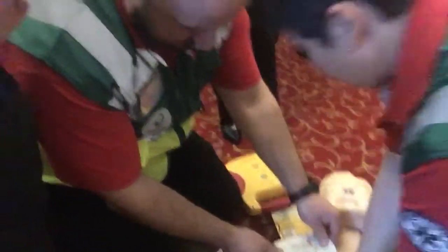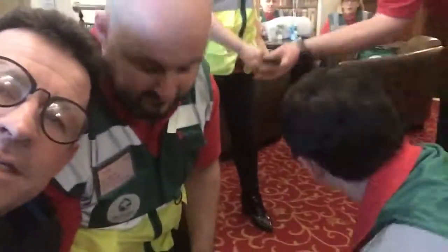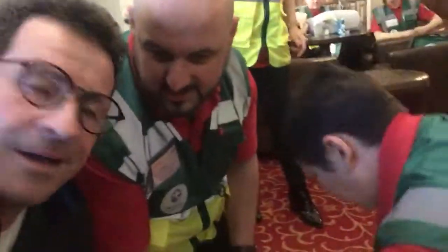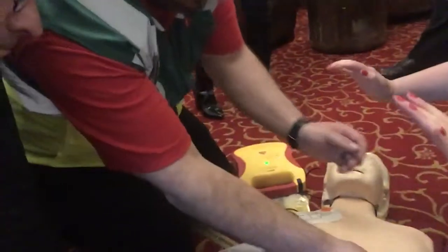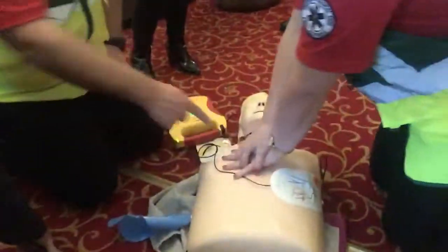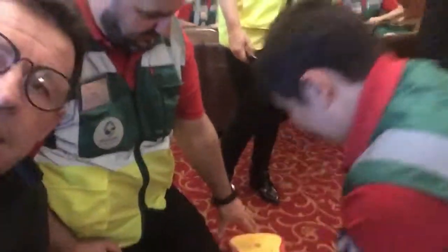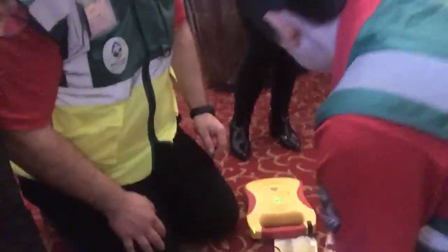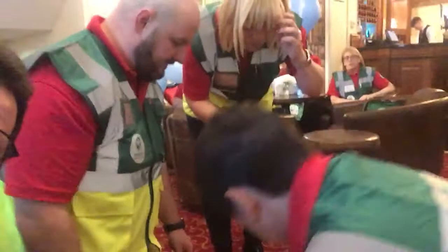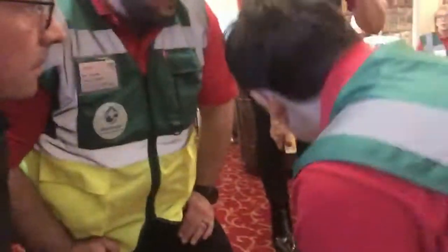Stick the pads onto the chest — one, two, three, four. Training mode. Call for help. Is it an electric shock machine? Yes, it's an electric shock machine, and you have to listen to it — it will tell you exactly what to do. It's telling us to place the pads on the patient's bare chest. This is a trainer version we use for training.